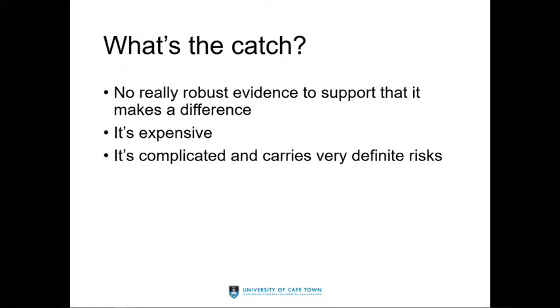So what's the catch with ECMO? Well, there's no really robust evidence to support that it makes a big difference. Okay, it's expensive and it's complicated and carries very definite risks. You have to anticoagulate your patient if you're going to run it long term, and that carries risks, and there's risks to these big cannulas going into patients as well.